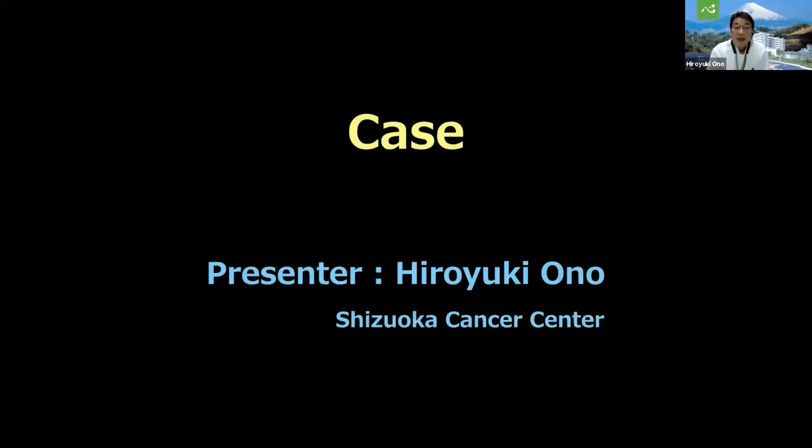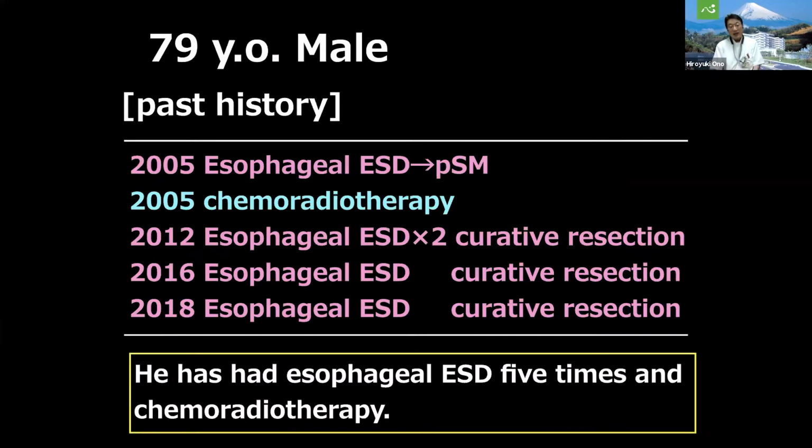Okay. Thank you very much for the kind introduction, Professor Kashida, and thank you very much, Professor Inoue, for inviting me to such an excellent and great live demonstration. It's my great honor to be here. So I'll start my presentation. Hello everyone, I'm Hiroyuki Ono, Shizuoka Cancer Center. Today's case is esophageal superficial cancer.